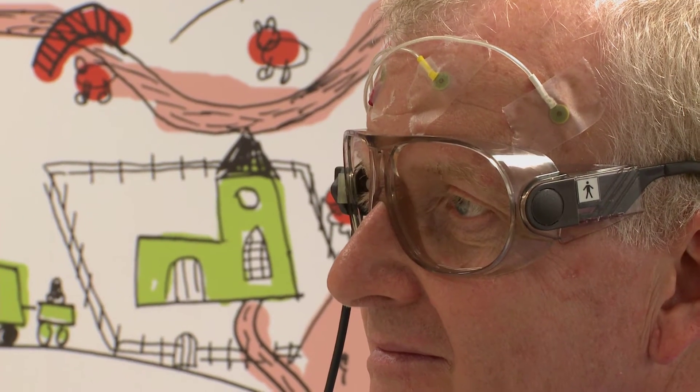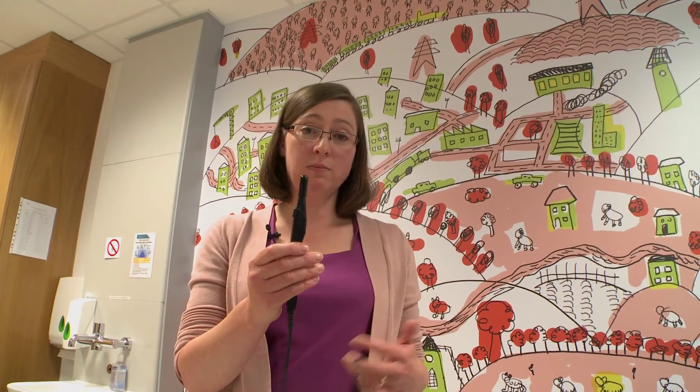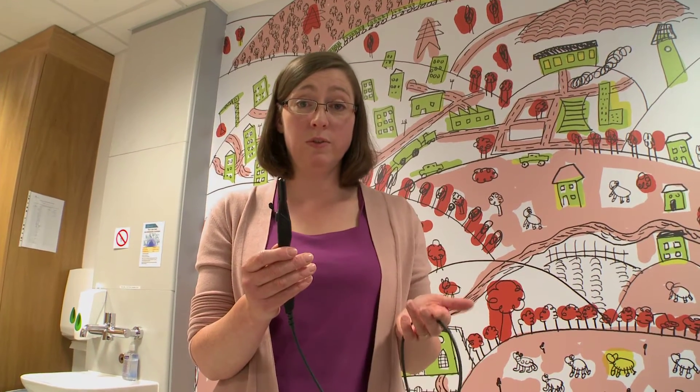The next step is to ask Stefano to wear these goggles, which are an important part of what we're going to do next. We also need this special tool, which we use to measure the position of Stefano's head and the position of all those little coils that we've just stuck on.